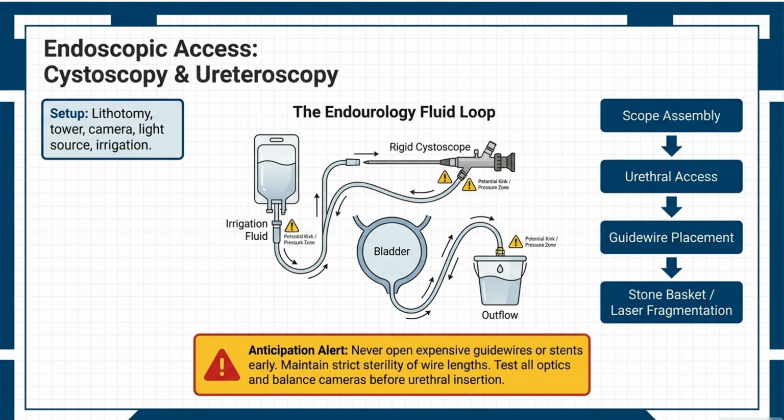Endoscopic procedures rely on proper setup of scopes, cameras, and irrigation systems. The workflow includes scope assembly, urethral access, and guide wire placement. Continuous fluid management ensures visibility. Maintaining sterility and avoiding premature opening of supplies is essential.